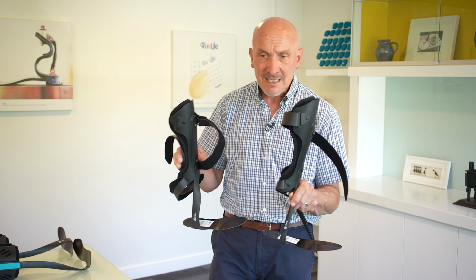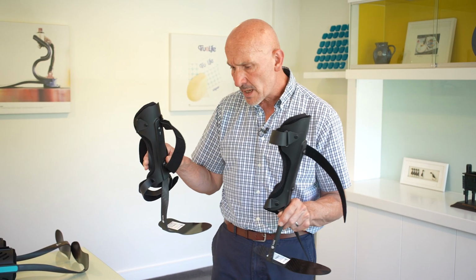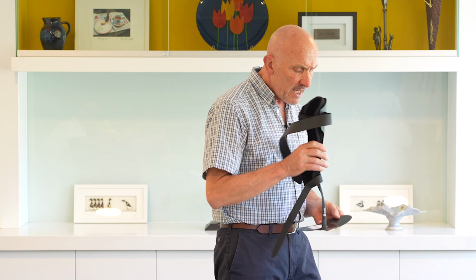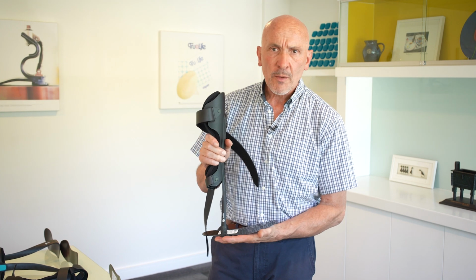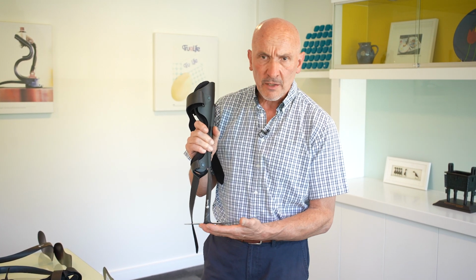The side arm is the secret to the differences between the models in the Matrix Max range and the Matrix range, and this relates to the weight of the patient. The thinner arm is for a lighter weight patient, say 60 odd kilograms, 65 kilograms. If you go beyond this with the weight of the patient too heavy, the arm will actually fracture.